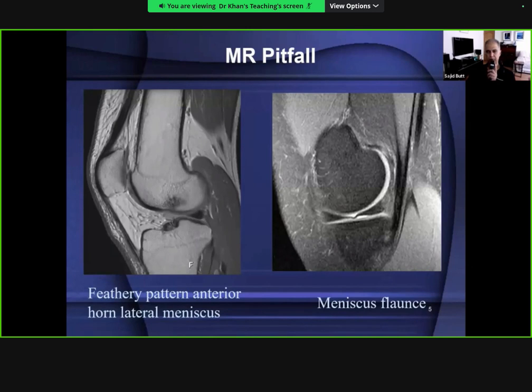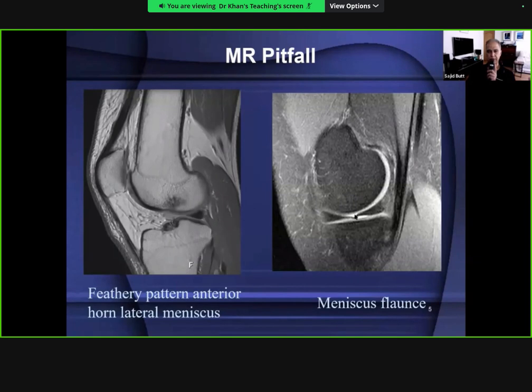The second normal variant or imaging pitfall is the phenomenon of meniscal flounce - a normal finding seen in both medial and lateral menisci. The meniscus simply looks a little wavy in appearance and contour; that's a normal finding.